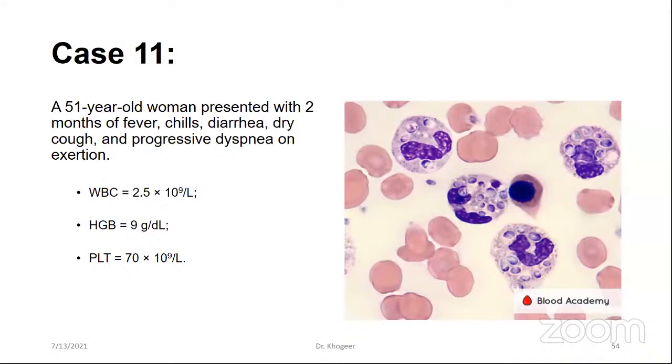But how can we use this term? We always correlate. While you are examining a peripheral blood and you see some neutrophils with increased granulation, you can say these are neutrophils showing increased or toxic granulation, likely due to GCSF or growth factor therapy effect.